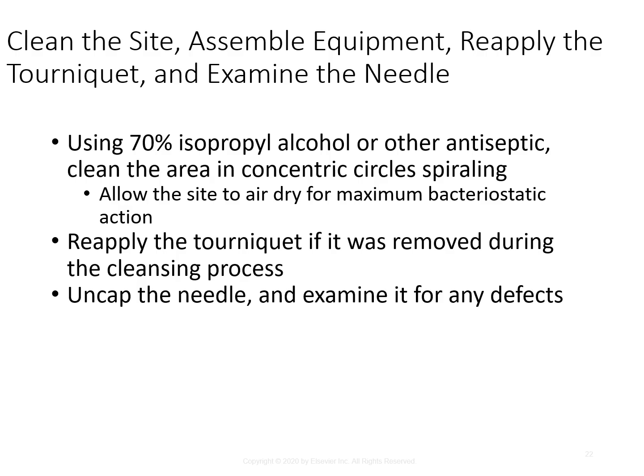As you become more proficient in routine venipuncture, removing and reapplying the tourniquet will become unnecessary because you will be able to locate the vein, scrub and dry the site, inspect the needle, and insert the needle within 30 to 60 seconds. So right now we're saying put the tourniquet on, find the vein, take it off, get everything ready, put the tourniquet back on. What this is saying basically is that eventually, once you get proficient at it, you will be able to put the tourniquet on and do all those steps within 30 to 60 seconds.